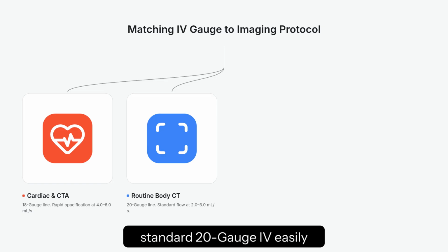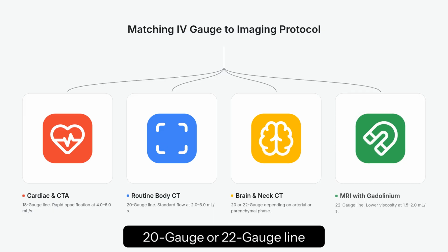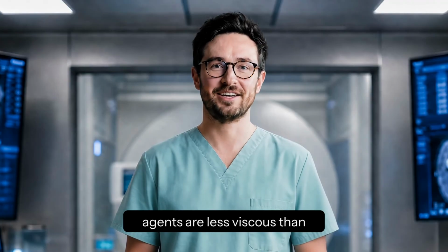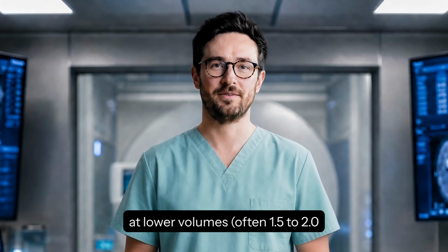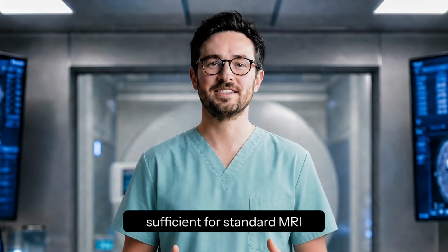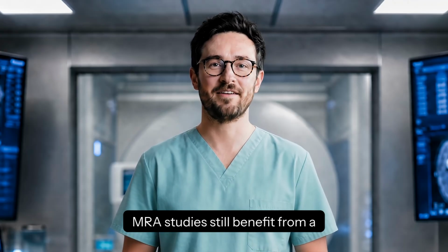Standard abdominal, pelvic, or chest CTs usually inject contrast between 2.0 and 3.0 ml per second. A standard 20-gauge easily handles these flow rates. Routine brain and neck CTs often utilize a 20-gauge or 22-gauge line, depending on whether we need an arterial peak or standard parenchymal enhancement. For MRI scans, gadolinium-based contrast agents are less viscous than iodinated contrast and injected at lower volumes, often 1.5 to 2.0 ml per second. Consequently, a 22-gauge line is frequently sufficient for standard MRI procedures, though dedicated MRA studies still benefit from a 20-gauge.